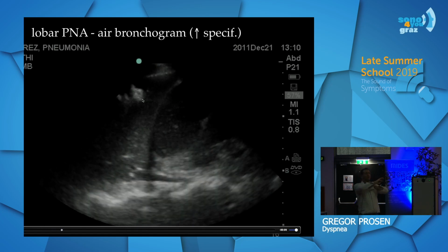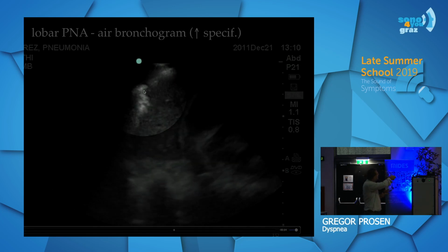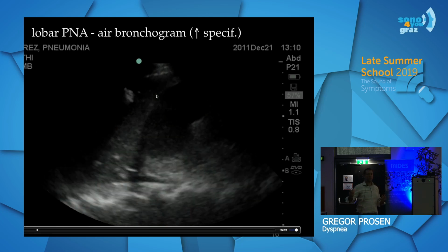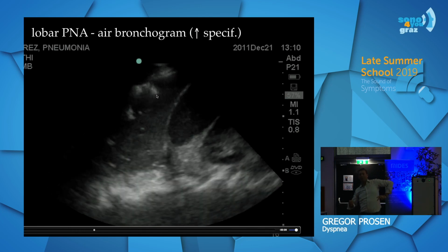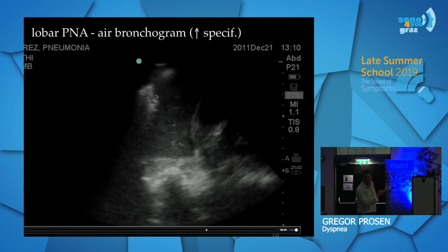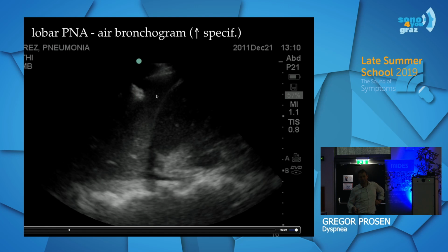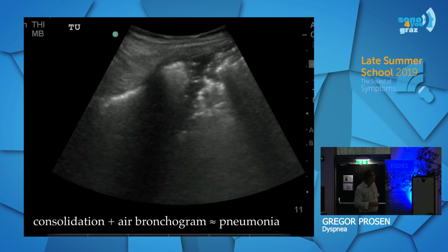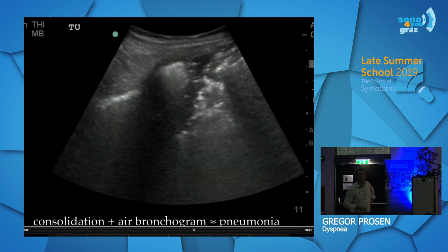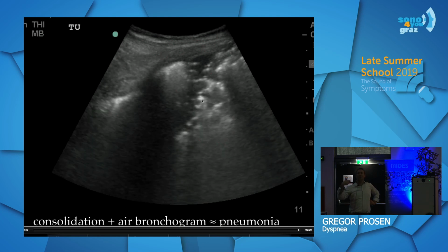All the alveoli are flooded with water. And this thing here is edge of pneumonia. Okay? So this is lower left lobus. Yeah? And I think it's clear it takes 10 seconds to know. You see all these specks inside here? That's air bronchogram. Again, consolidation, pneumonia, air bronchogram.